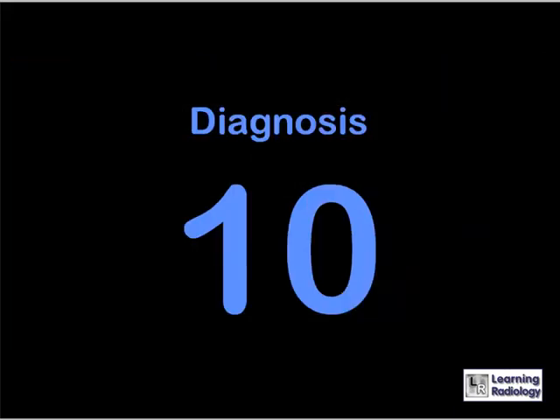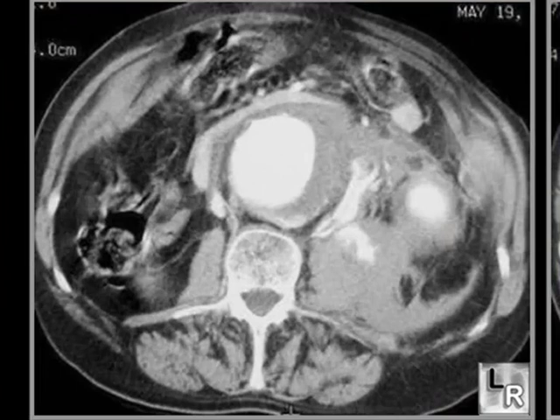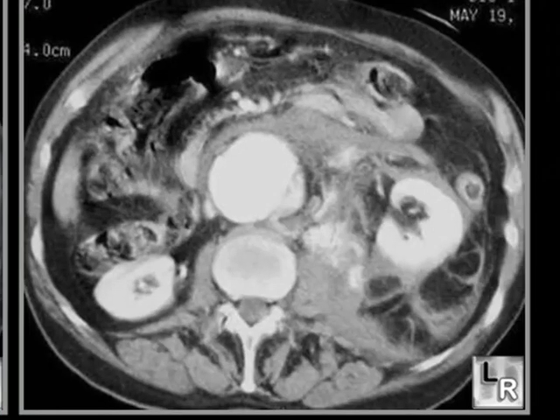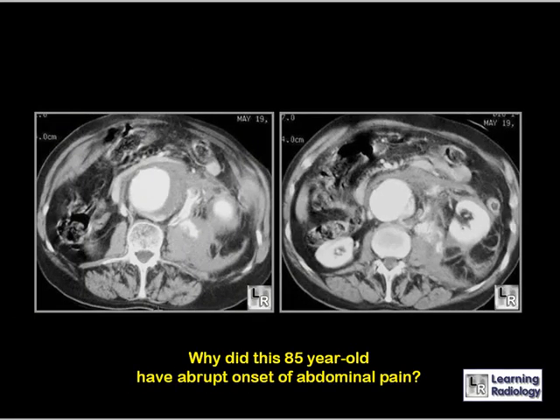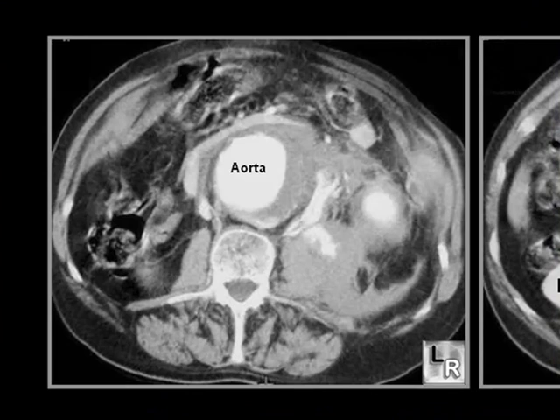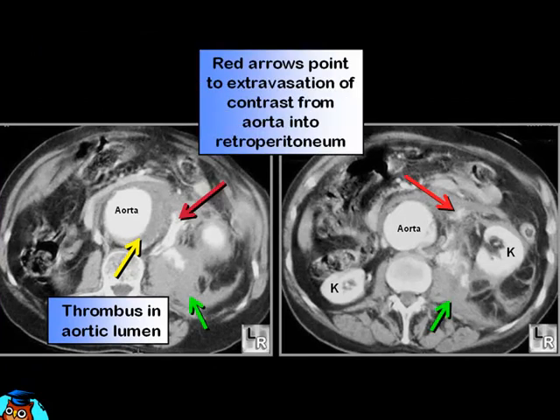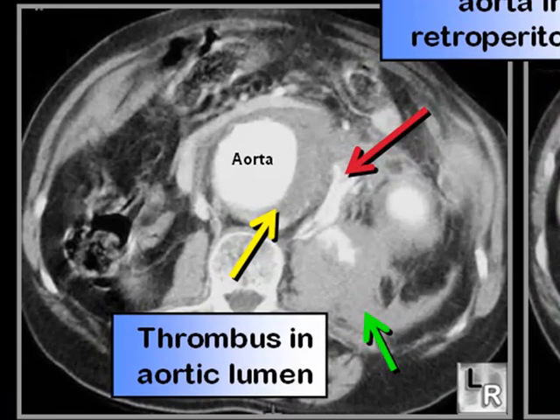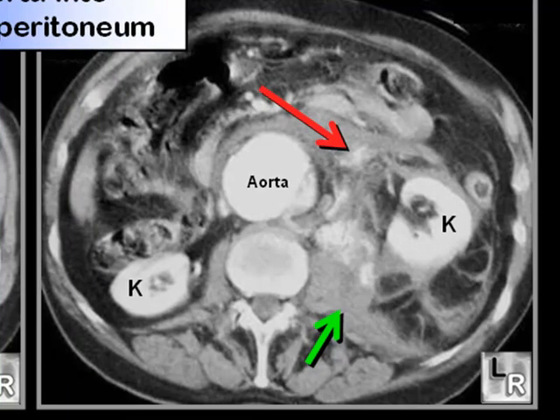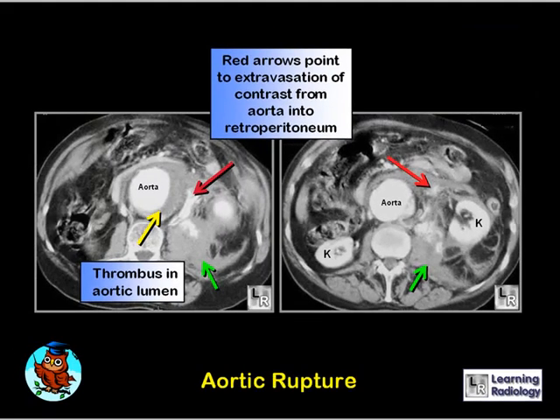Why did this 85-year-old have an abrupt onset of abdominal pain? On two contrast-enhanced CT images of the abdomen, there is thrombus separating the contrast in the aorta from the aortic wall. More critically, the red arrows point to contrast that has actively extravasated from the aorta into the retroperitoneum. The green arrows point to less acute blood, which is less dense on CT. This is an example of rupture of the abdominal aorta, and this patient did not do well.